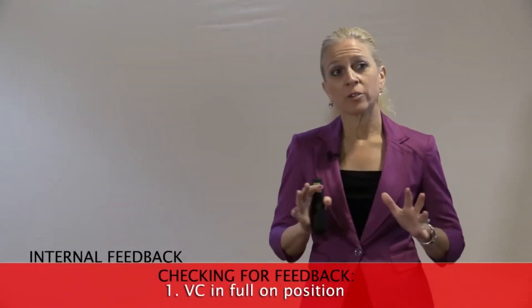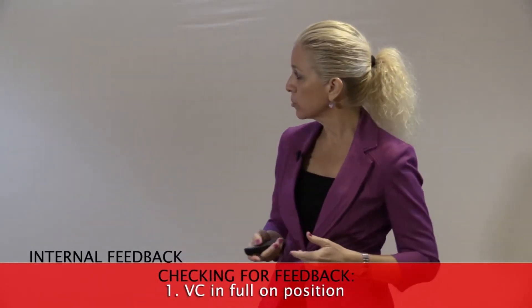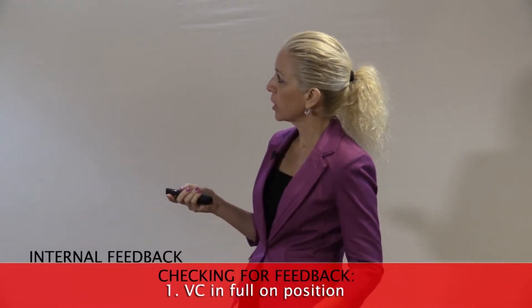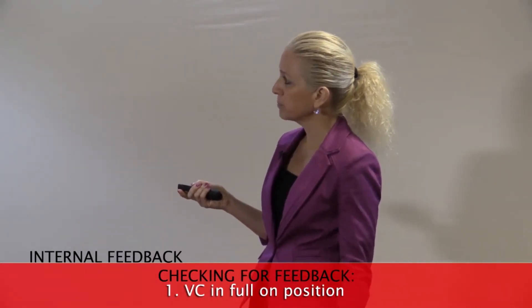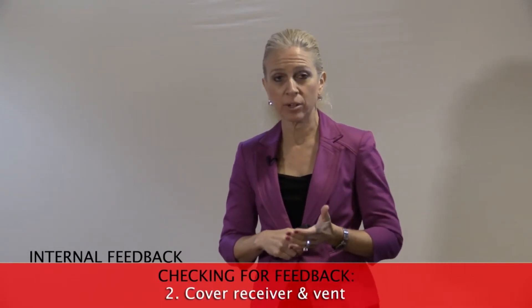So how do we check for internal feedback? How do we know that it's actually internal feedback? Well, there's a very easy way to check for it. We're going to turn the volume control to full-on position, and we're then going to cover the receiver and the vent of the hearing aid.